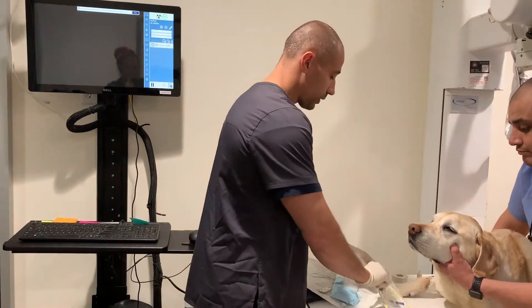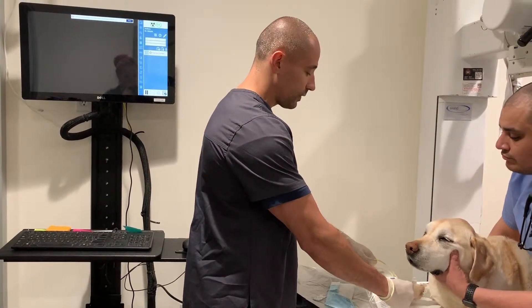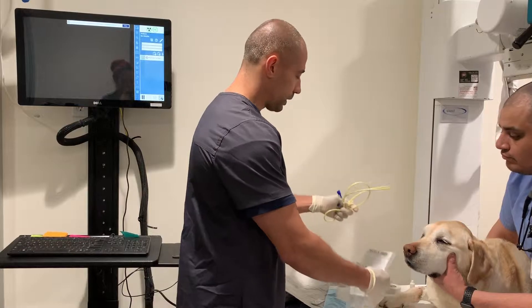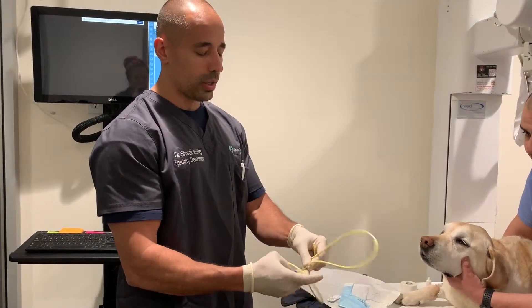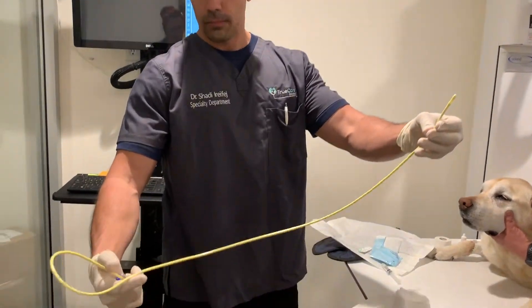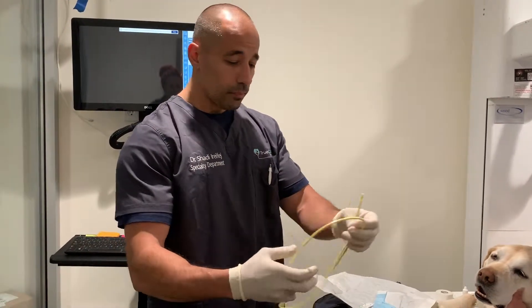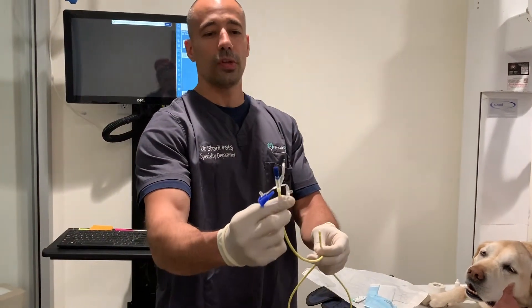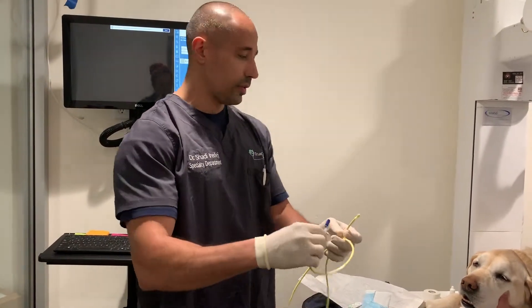We're then going to have our nasogastric tube. There are many different types of nasogastric tubes, many different sizes and lengths, and the veterinarian will pick the appropriate one for the particular dog. Your feeding tube basically looks like this — this portion will go into the dog's nose and into their stomach, and this is the portion we're going to use to empty out any fluid in the stomach or to place food into the stomach.